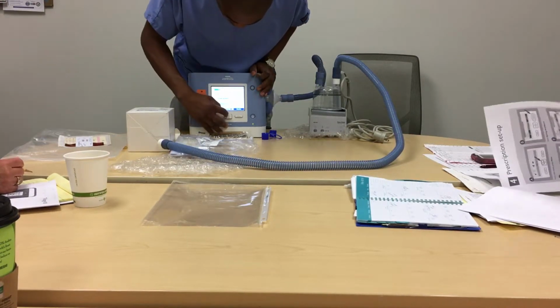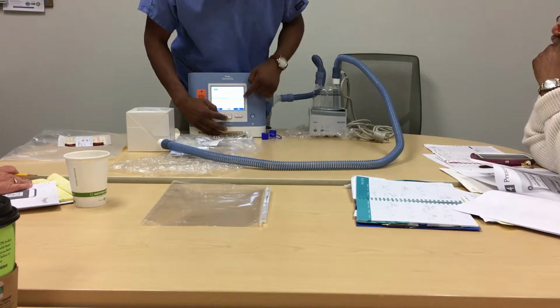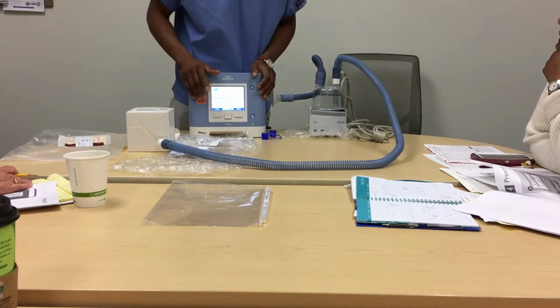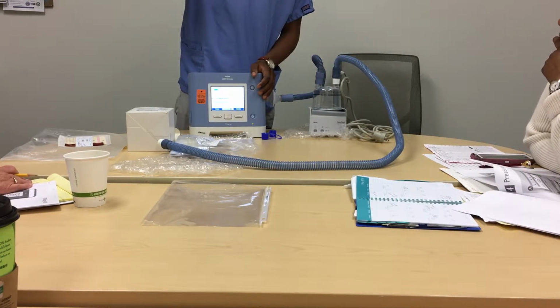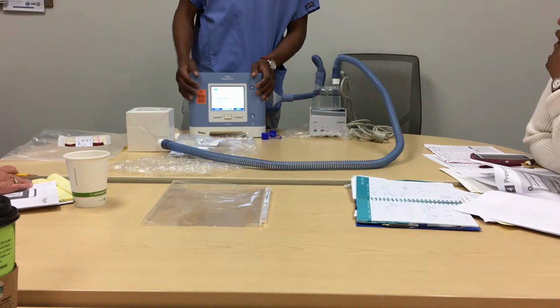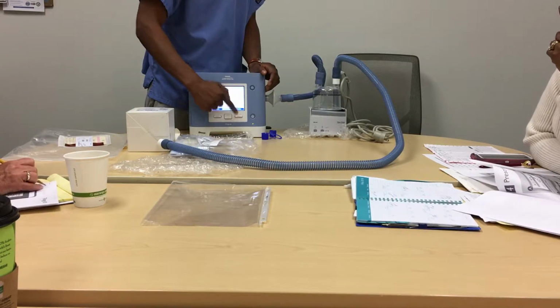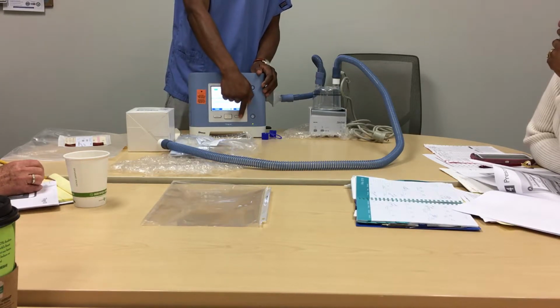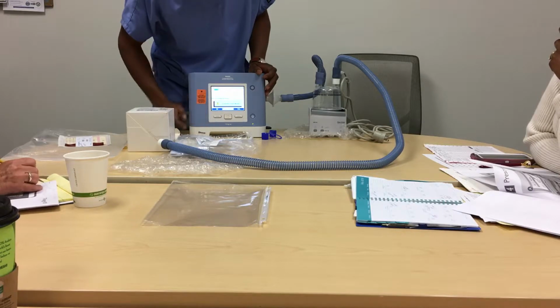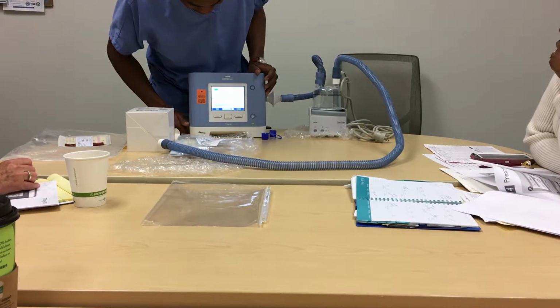So going back to the modes, if you highlight it, you click modify, you can scroll through what you need, and to set it, just click OK. It takes you down to your next set of parameters. Just the right button is the selection? The right is to back out. Once you are done, it tells you to confirm the mode, and just click OK or yes, and it's set.